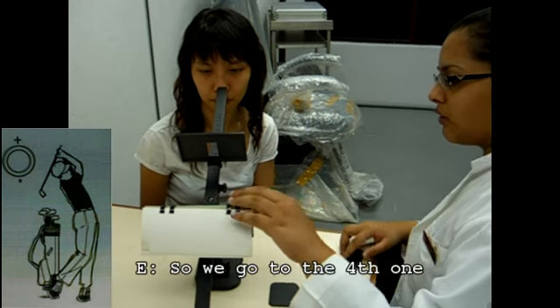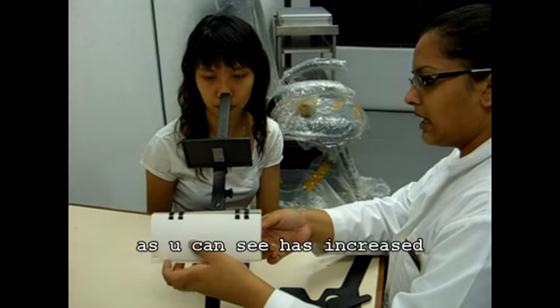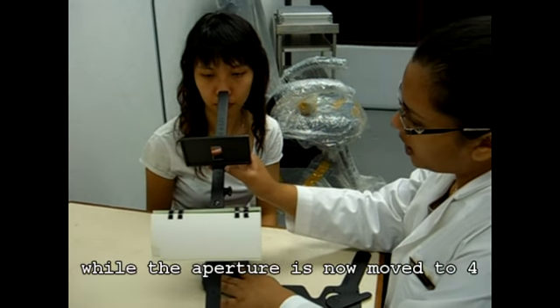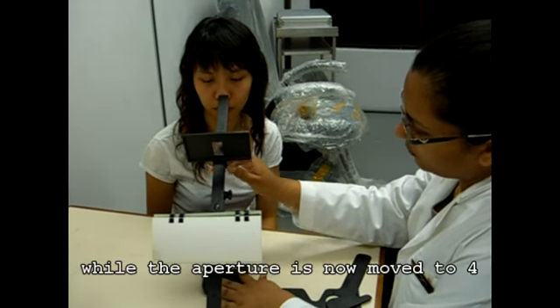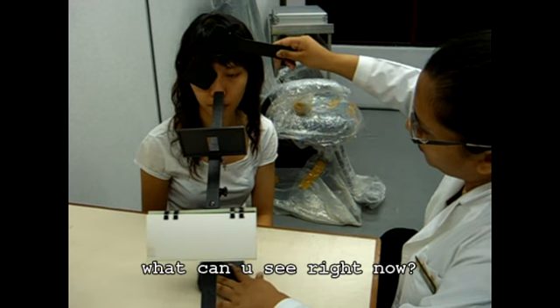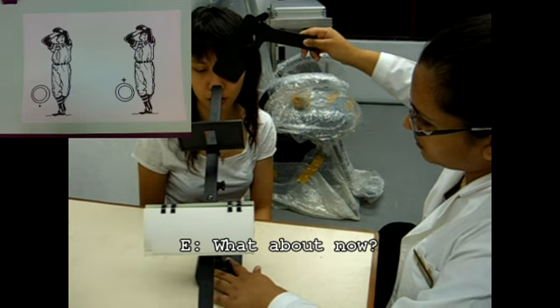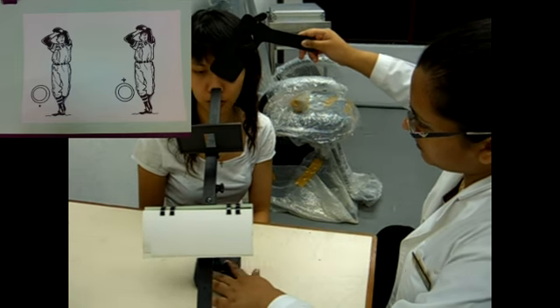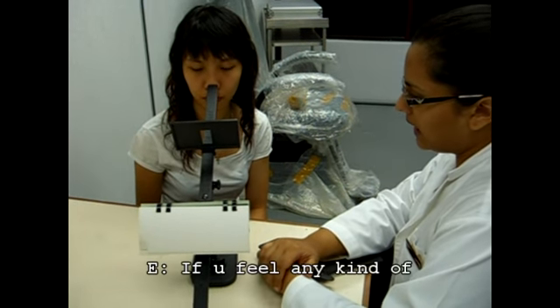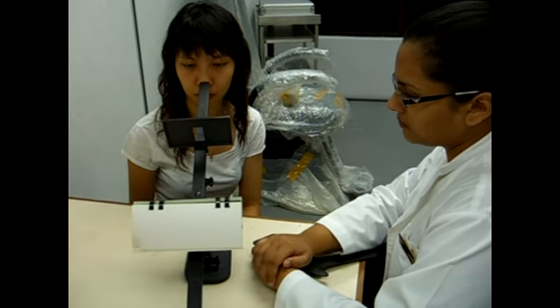Okay, so we'll go to the fourth one. The distance between the two images, as you can see, has increased. Again, the booklet is placed at 0, while the aperture is now moved to number 4. What can you see right now? A baseball player, a cross, and 2 circles. And what about now? Baseball player, 2 circles, and a dot. Again, try to fuse those two images into one. If you feel any kind of eye strain or headache, you can just let me know. Take your time.